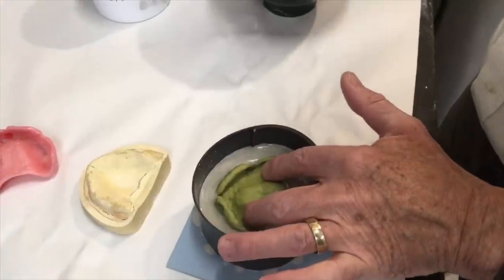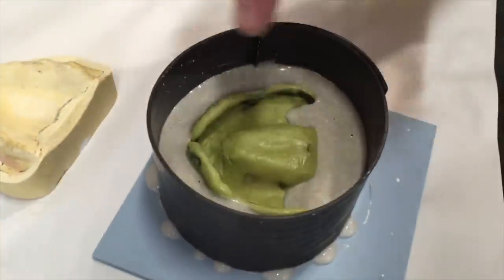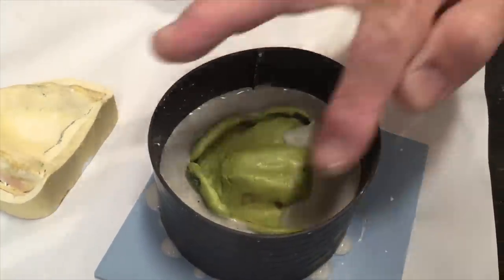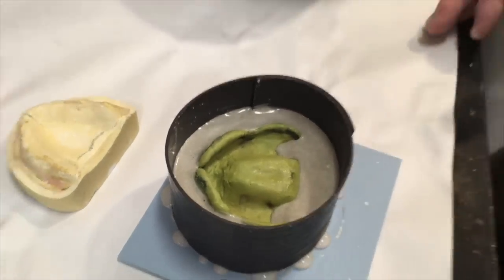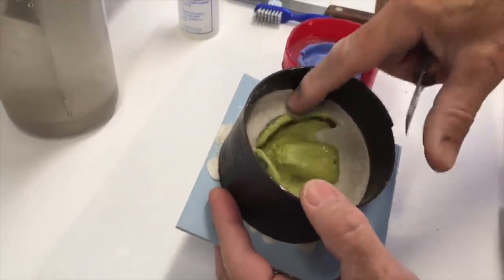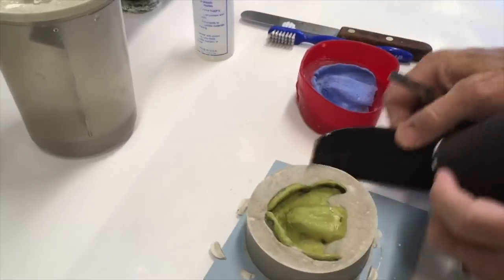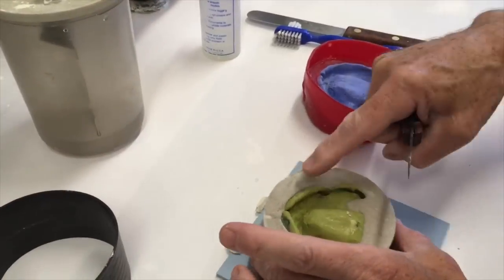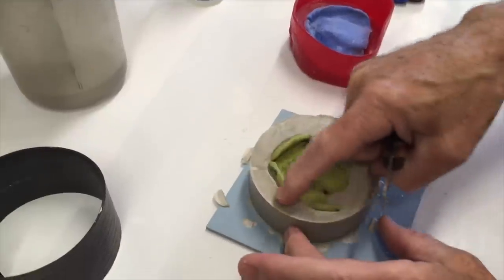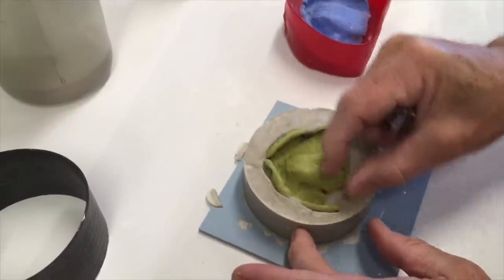Make sure you're not off to the side. If it's going to run in the back like it will in a lower, just let it run in — we're going to remove that before we pour it up. Now this is fully set; it took about five or six minutes but it's set enough to work with. I'm going to peel that magnet off. Basically I want to refine this land area down to my blue line, exposing the amount of periphery that we want to see in our final denture.